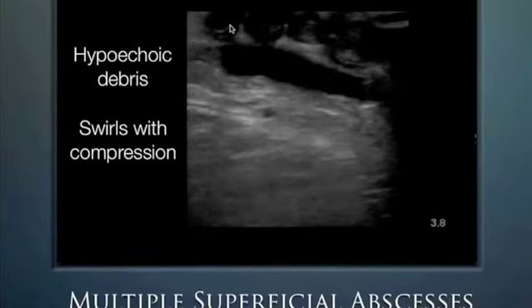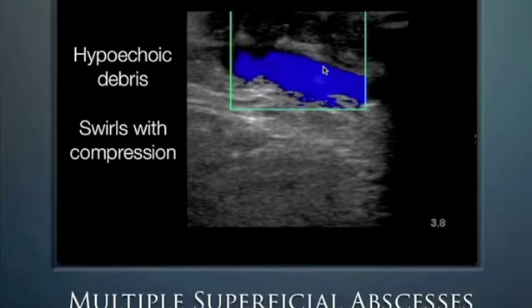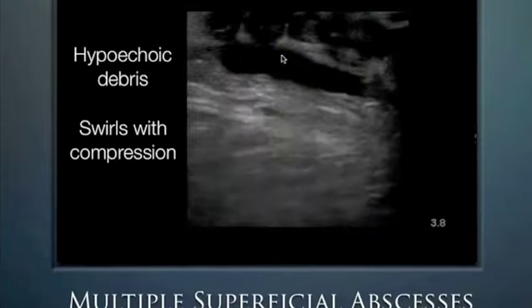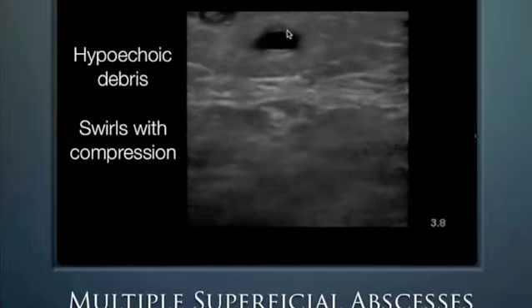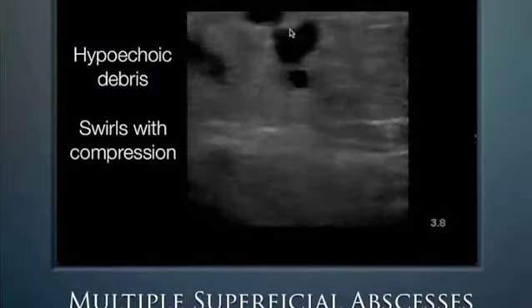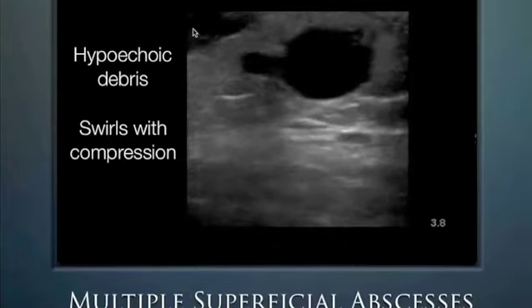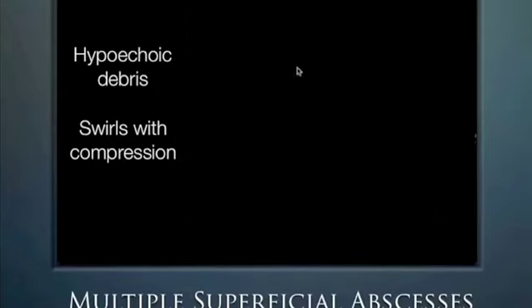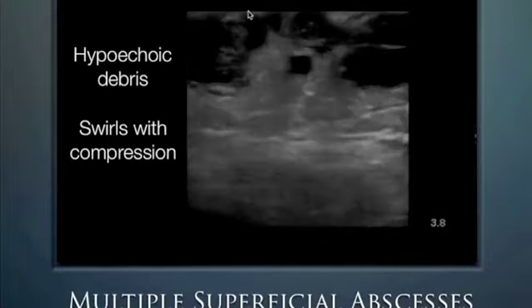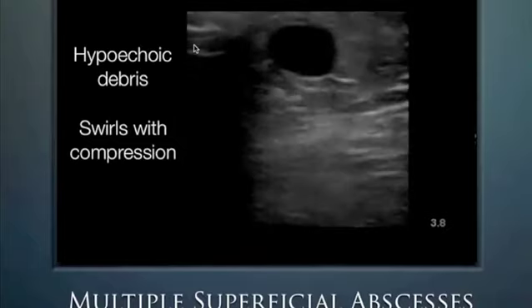And this patient has multiple little abscesses along here, right adjacent to this vascular structure when we apply the color flow Doppler. And so this was a very tricky one. We wanted to drain it, but stay clear away from the vascularity and just get into the abscess only. And we can see this network of abscesses here as they're going along, and with various areas of vascularity that we're trying to stay away from. And ultrasound is good because it helps us really focus ourselves on staying with the compartment of the abscess and not getting into the vessels.